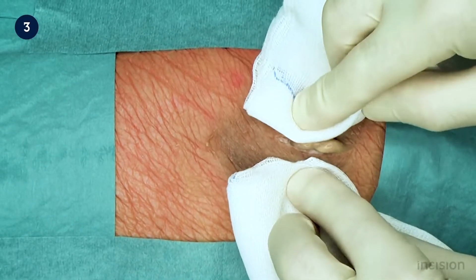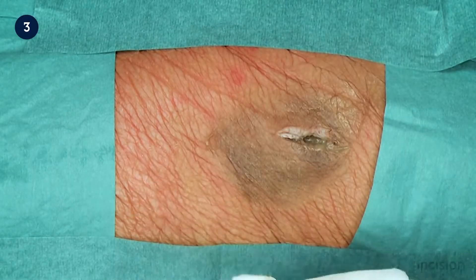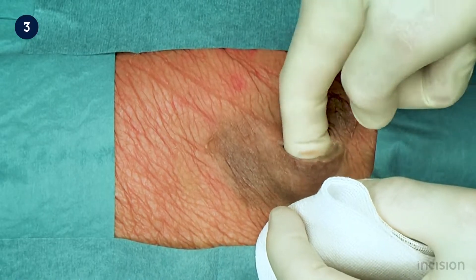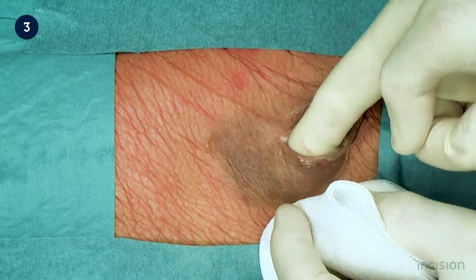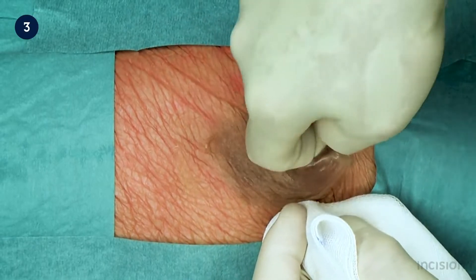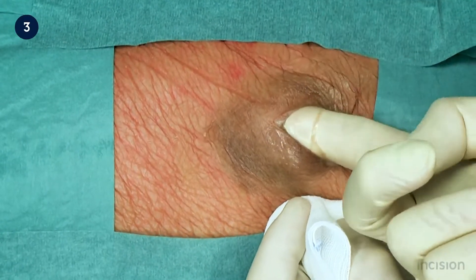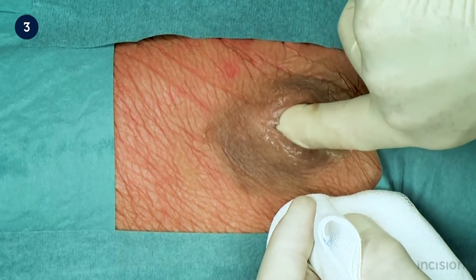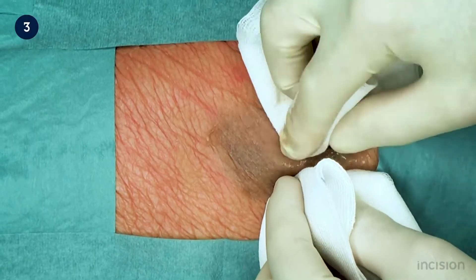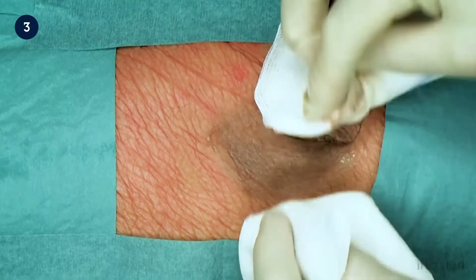If underlying malignancy is suspected, biopsy of the abscess wall or overlying skin can be performed. Provided that there is no suspicion of a foreign body causing the abscess, a gloved finger can be introduced to the cavity to assess the depth and break up any loculations. An instrument, such as a hemostat, can also be used to do this. All areas of the abscess cavity are checked to ensure that all loculations are broken up and to permit proper drainage.